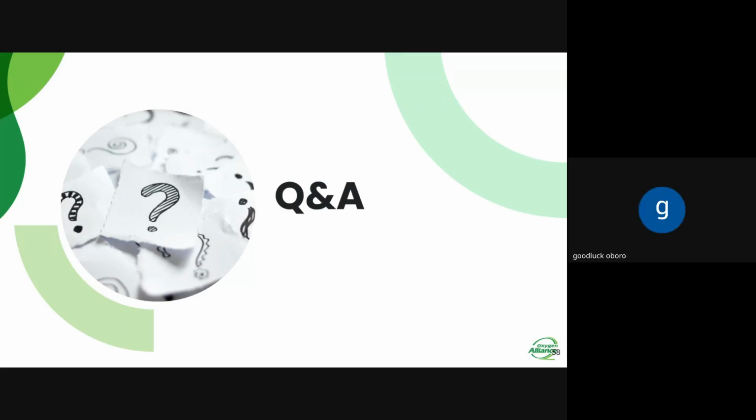For adults, you can go beyond 8. For some it can go above 8, based on clinical judgment, for adults. But since the range is 5 to 8, okay. What about the humidifier?